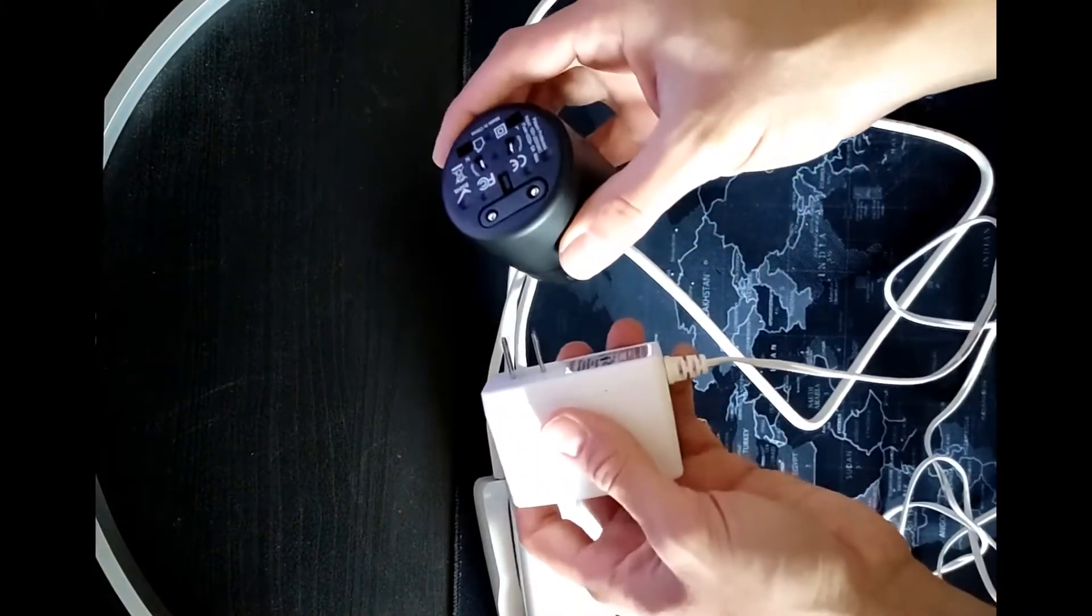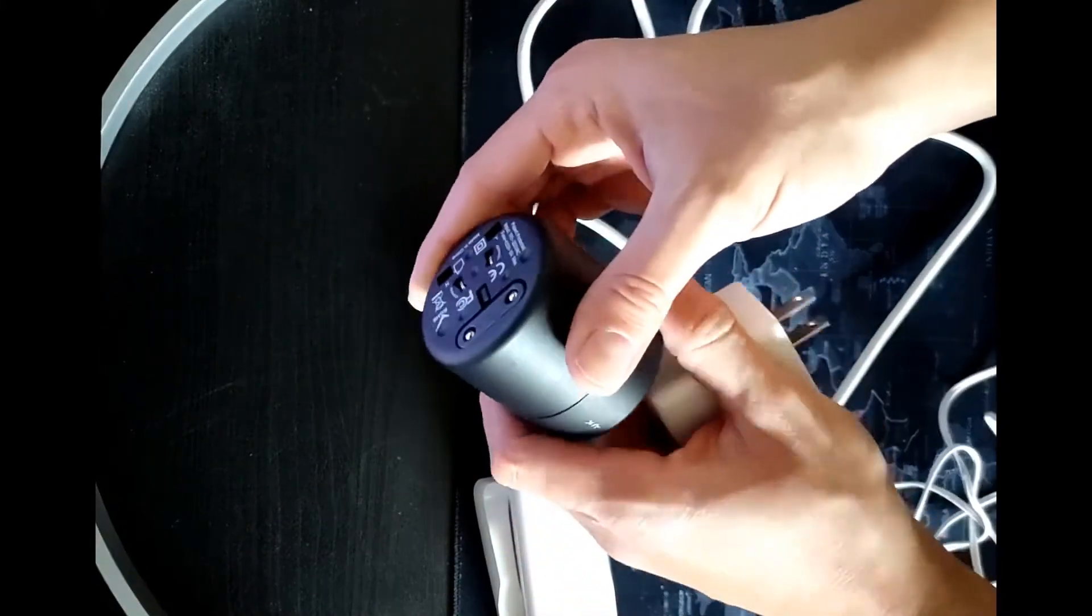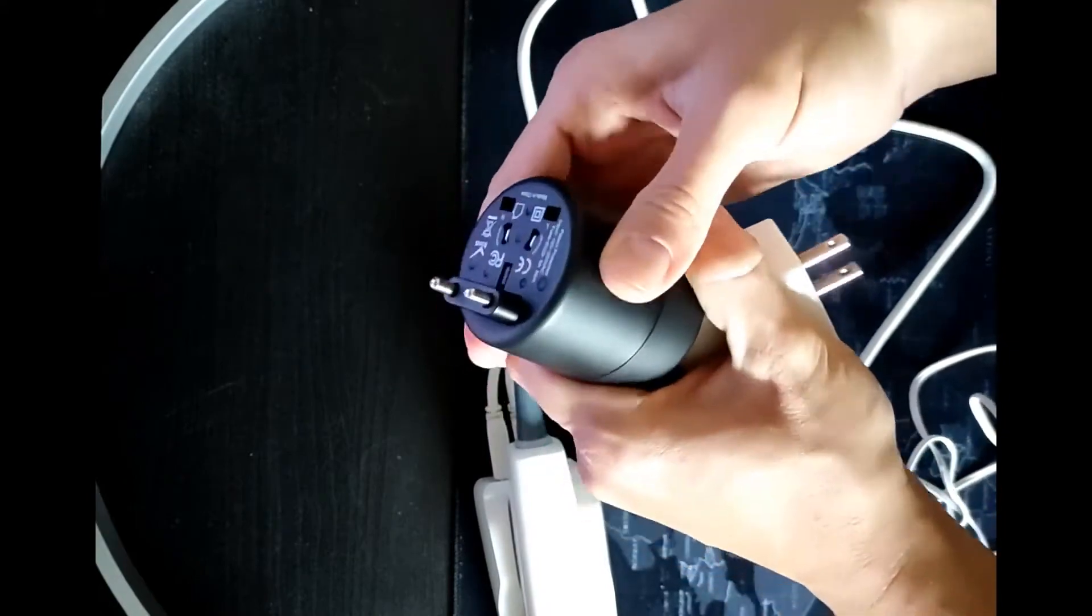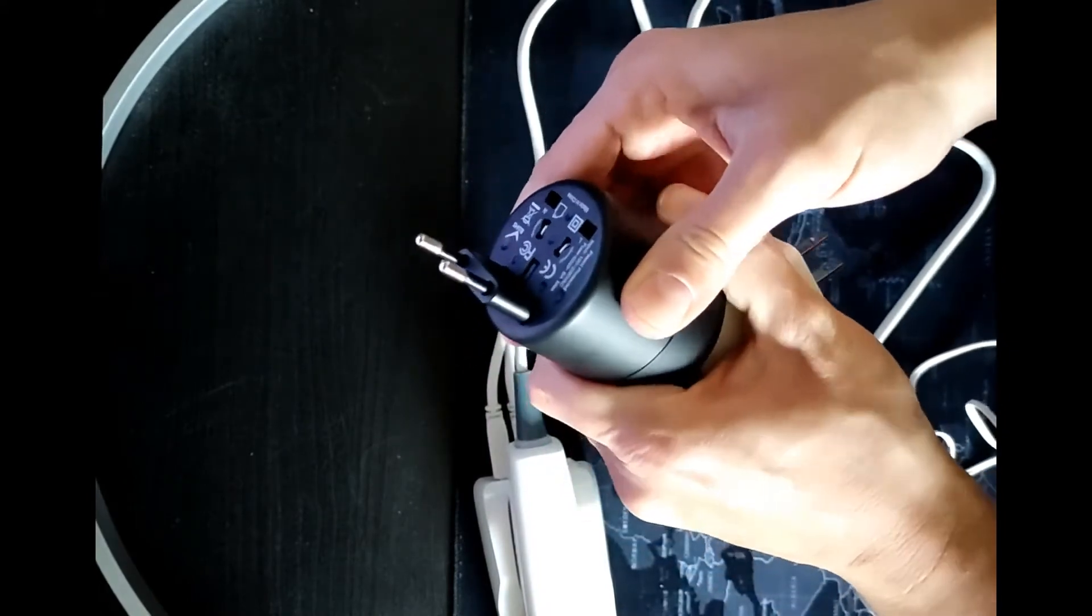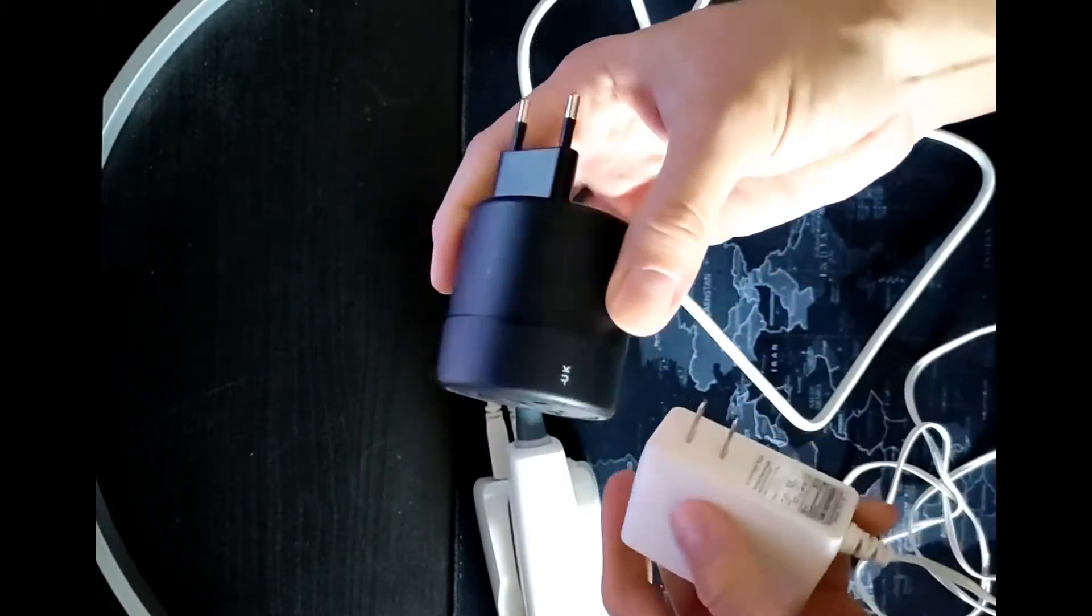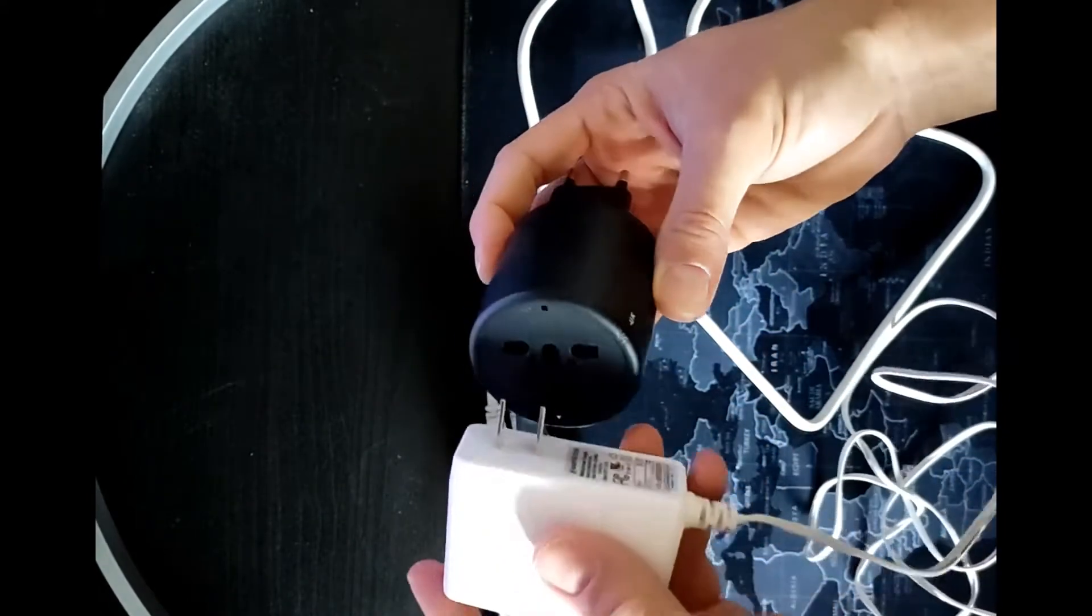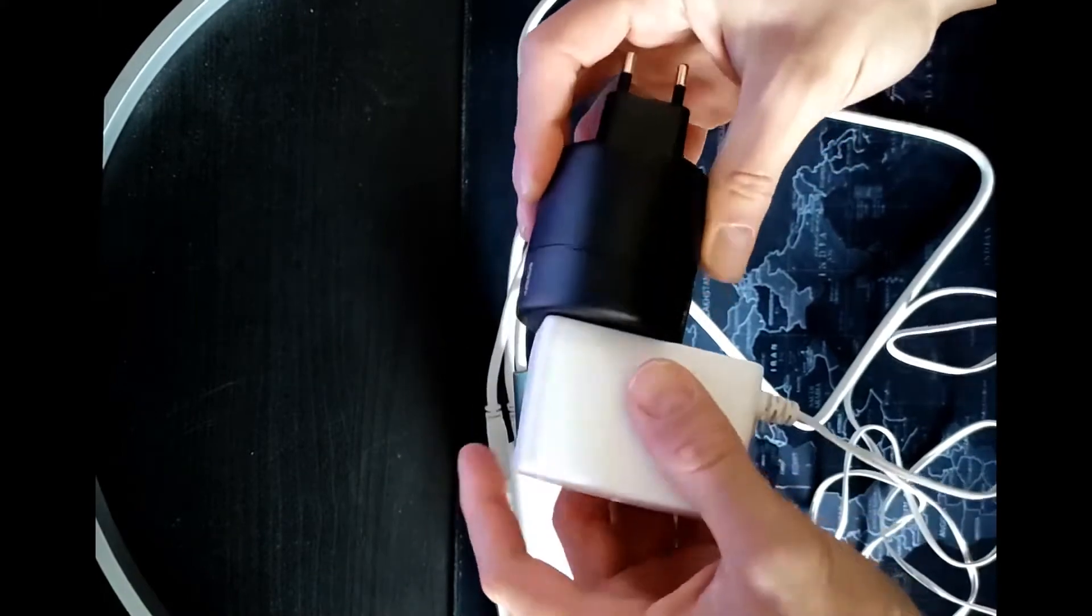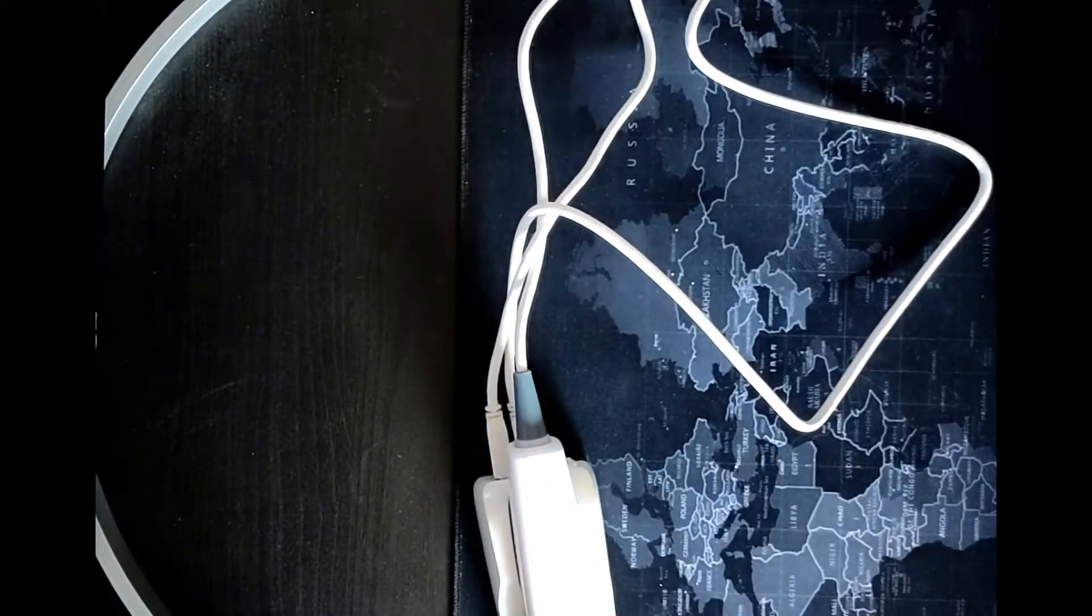Proceeding with the installation, here you are, the power adapter. Rotating the upper part of the adapter, you can choose the socket that you need.